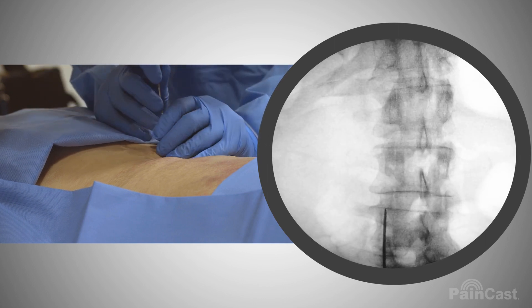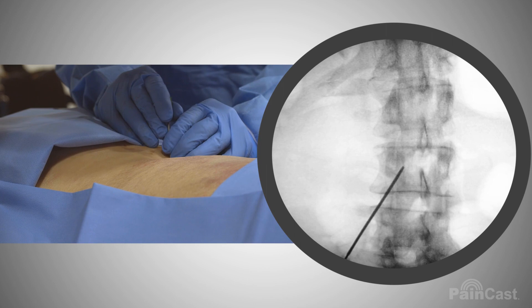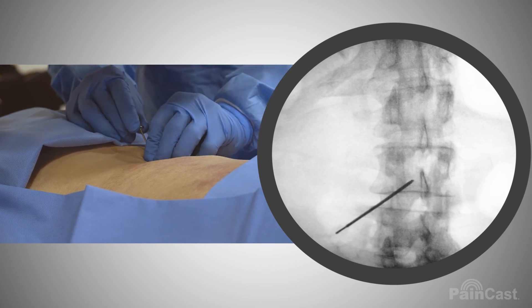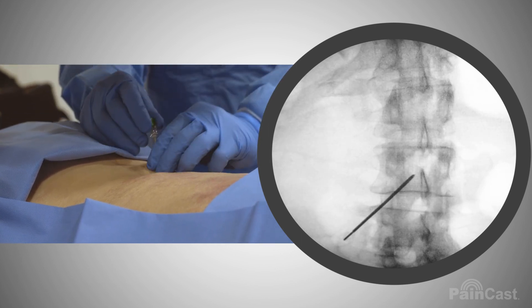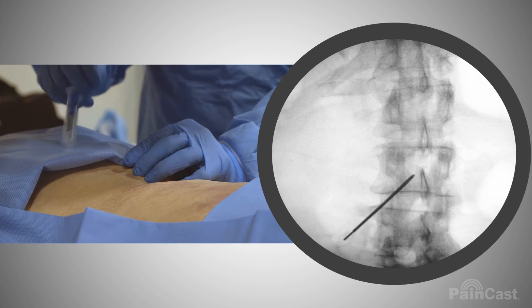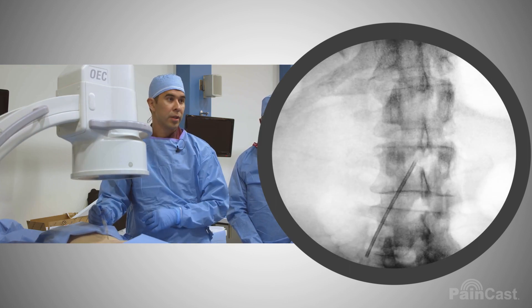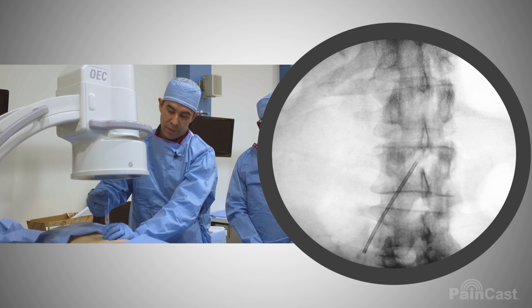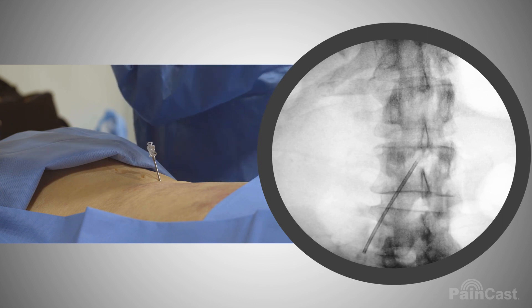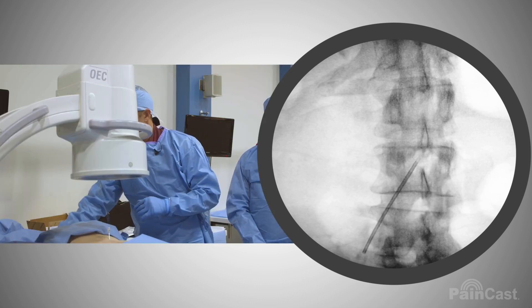I'm going to enter in and plan on having bone as my endpoint of the lamina above. We're going to do loss of resistance in a typical way. One of the main important points is getting into the center of the space, because if our target's on this side and we enter here, we have to go over the cord and out — it makes it more challenging. So if we could get it right in the middle, that's what our goal would be.